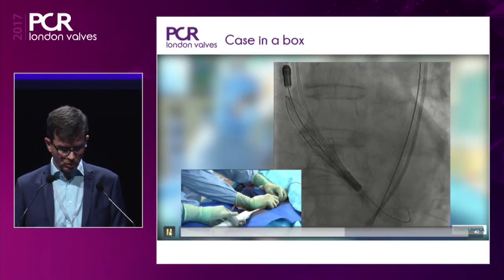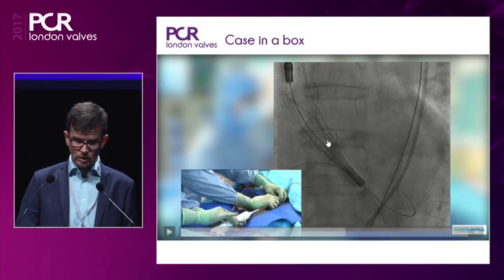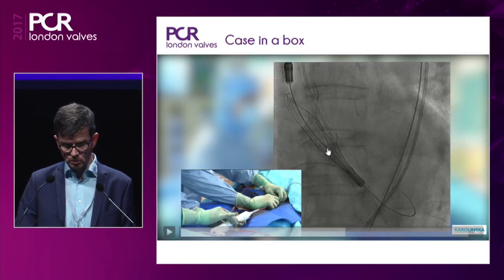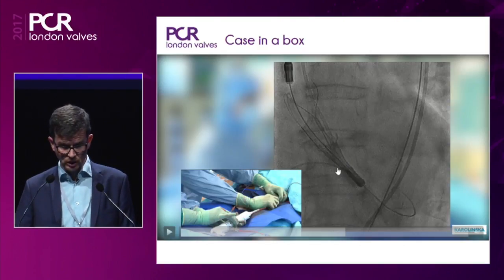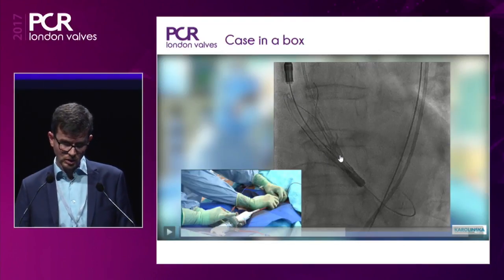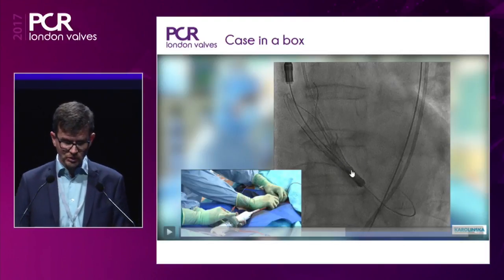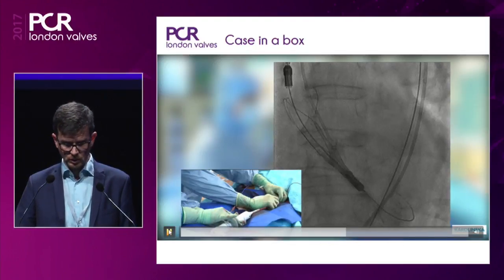Now we have deployed handle number one, which means the upper crown is open and the stabilization arches are open, but the lower part is still not open. This is the so-called top-down deployment — you have stabilization from the upper part of the stent, and when we open number two, you will see the lower part fly open almost like a balloon-expandable valve.